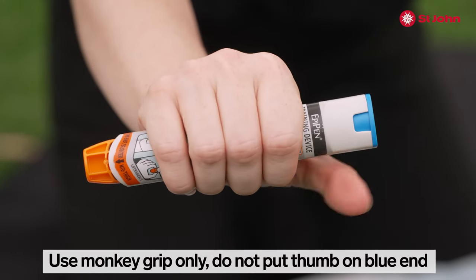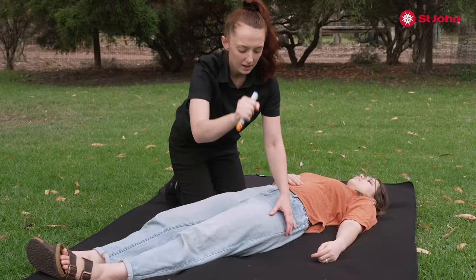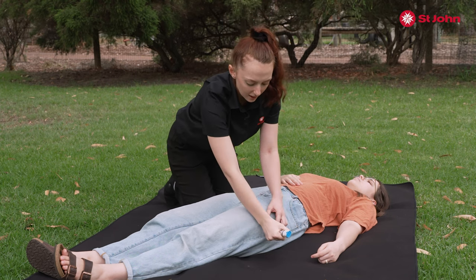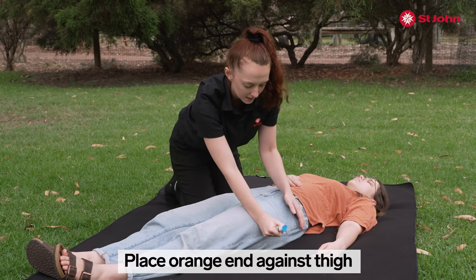Grip the EpiPen with a monkey grip, no thumbs on ends. Line it up so that the orange part is to the mid outside of the thigh, halfway between the hip and the knee.